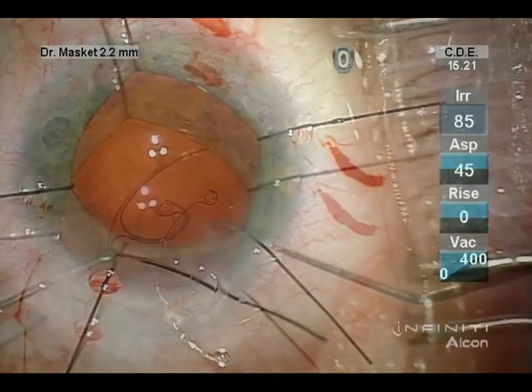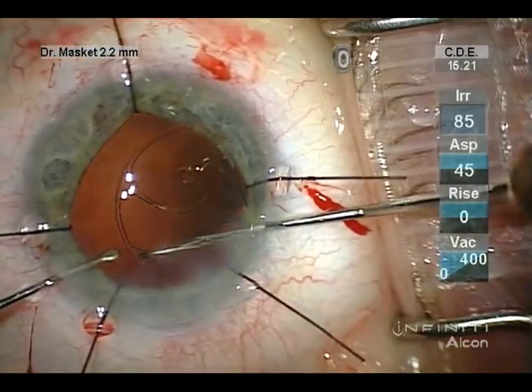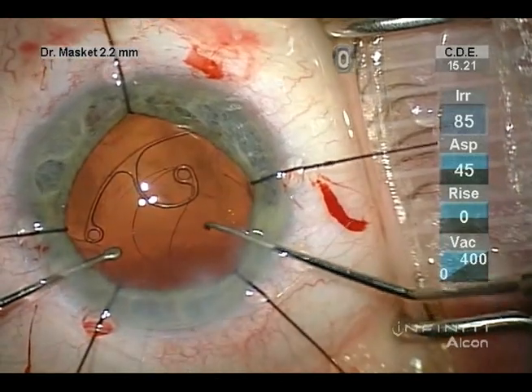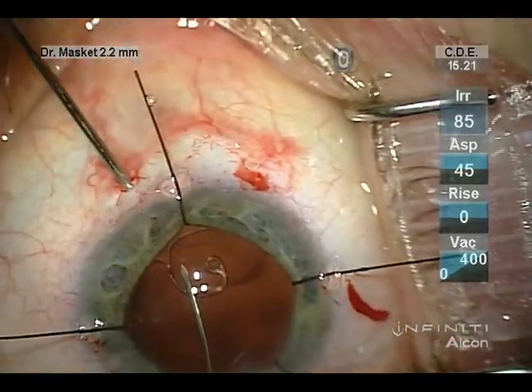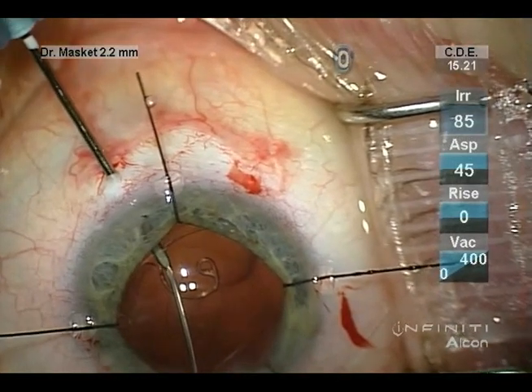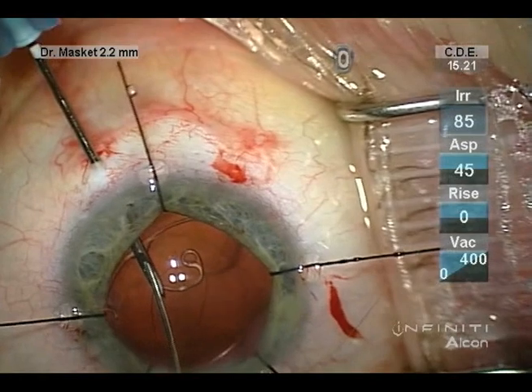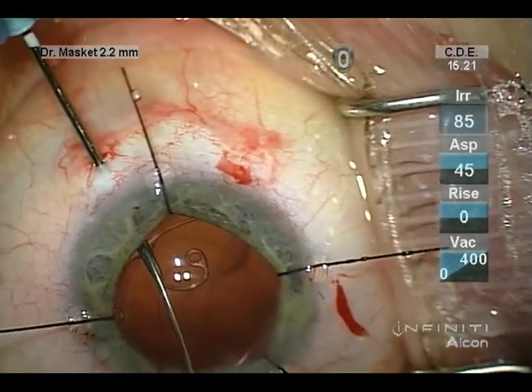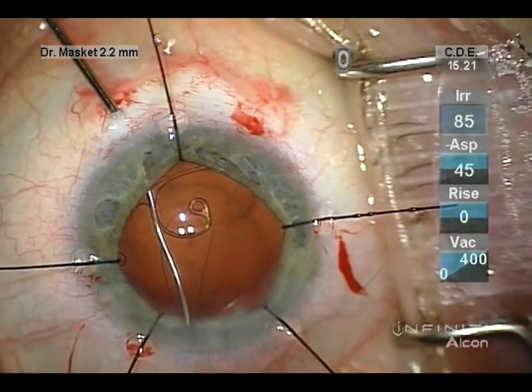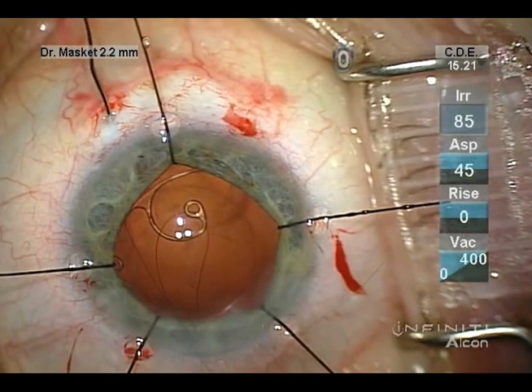Once the bag is emptied, the capsule support hook is removed, and an Ahmed capsule tension segment with preloaded double-armed 10-0 polyester suture on a PC7 needle is then passed into the capsule bag. Both needles are then passed through the sclera and docked into 25-gauge hypodermic needles, which have been bent in an ab-interno fashion.